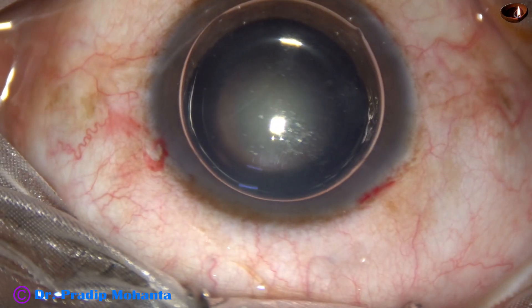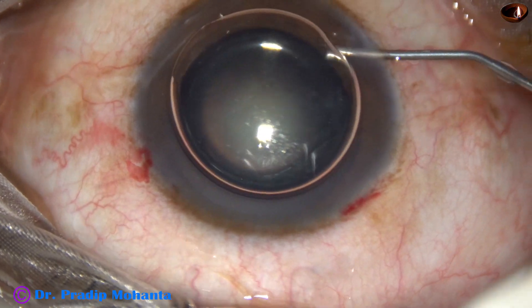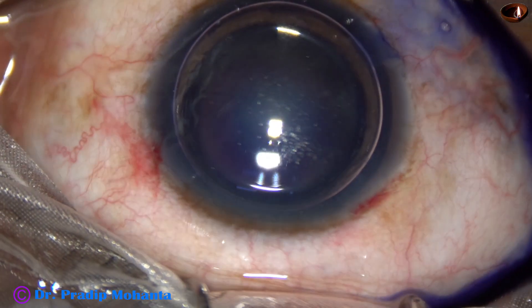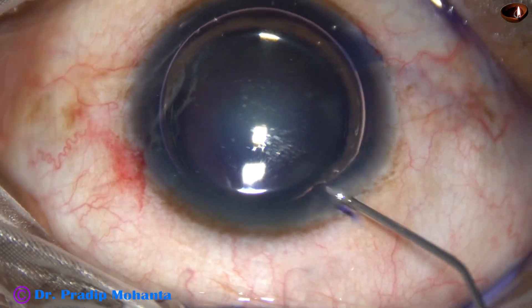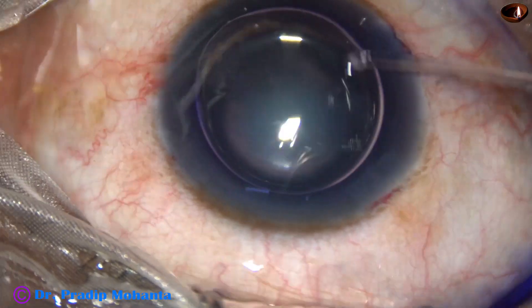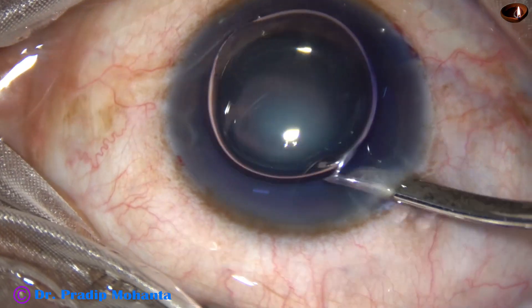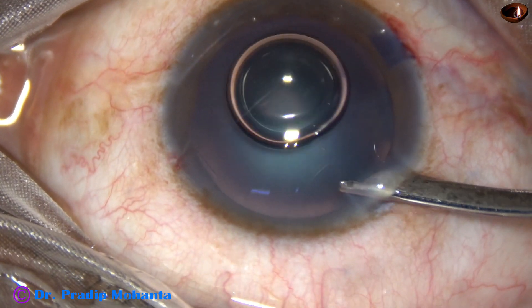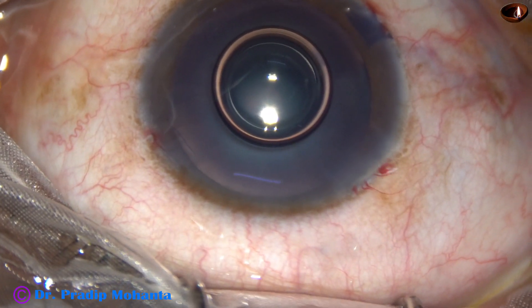The anterior capsule is stained with trypan blue dye. It is applied underneath an air bubble. This is a bit of adrenalin to keep the pupil dilated during surgery. The dye is washed out, and we see that the capsule has been stained nicely.